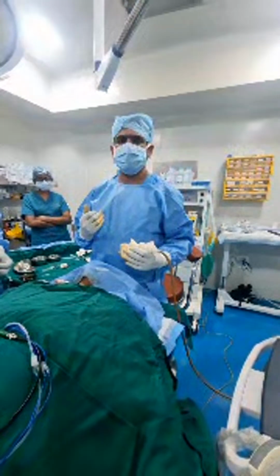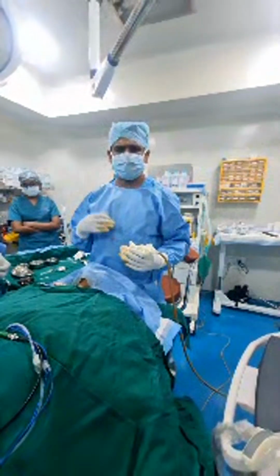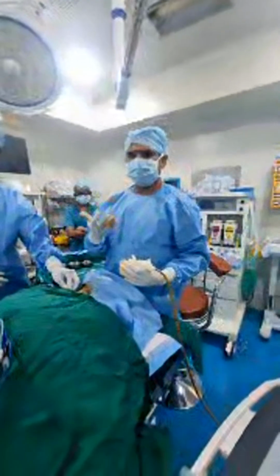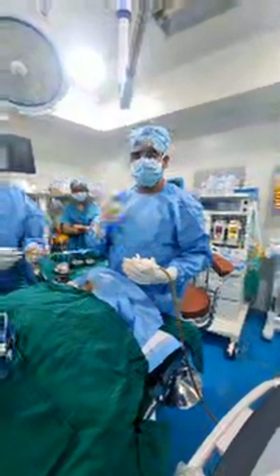Sometimes we can use laser. Microwave ablation is commonly used, and radio frequency ablation. Ablation means destroying specifically only the tumor, such that there is no need of lifelong thyroid hormone replacement, so that we are saving the rest of the normal thyroid from destruction or removal. Especially with surgery, where the entire lobe or the entire thyroid is removed, lifelong hormone replacement therapy is required, and a scar may remain.